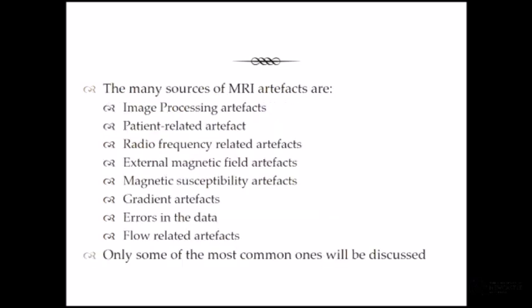There are many sources of artefacts. Some of these can be image processing. When you collect all your data, you send it away to your array processor and it does something funky with it and gives you an artefact.